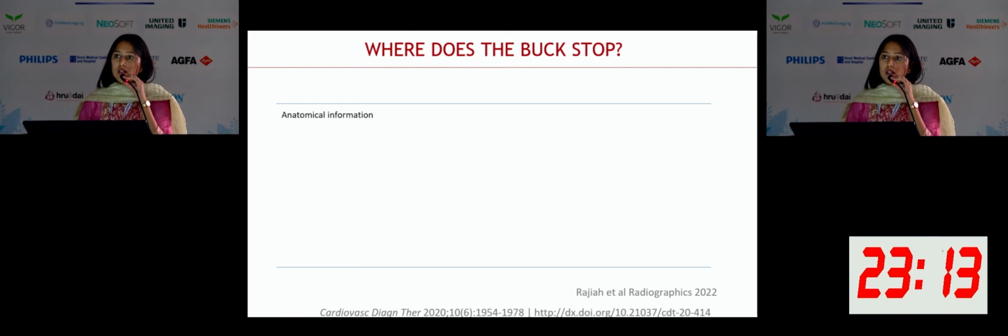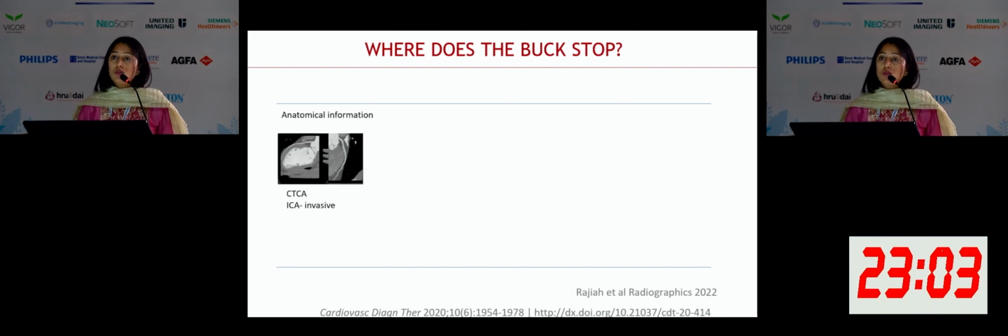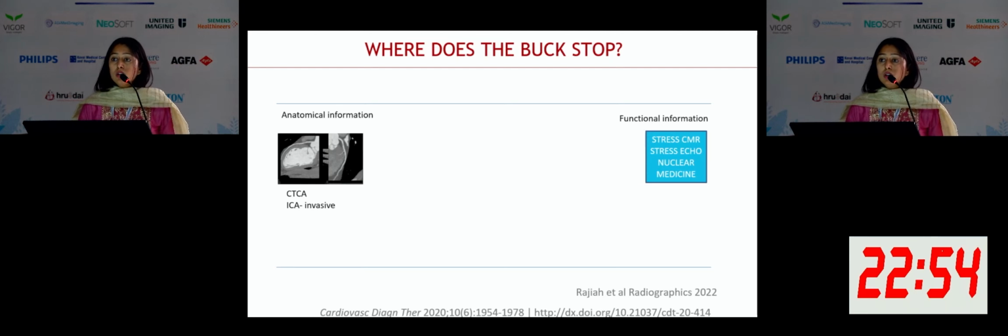So where does the buck stop? If we want to know whether the patient needs to go for OMT or revascularization, for revascularization we need the anatomical information. CT is fantastic, so is ICA, but it is invasive. But we also need the functional information. We need to know whether it is hemodynamically significant stenosis or not. To know that, there are techniques like stress CMR, stress echo, nuclear medicine, but they do not give anatomical information.